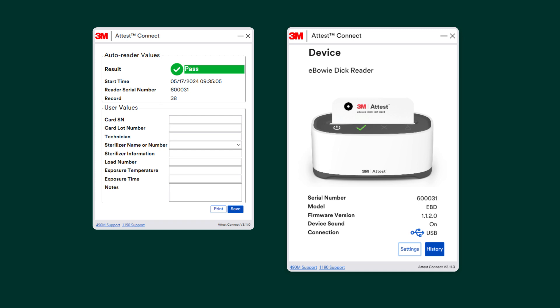In this example, the test card is showing a pass. You are able to add in the card's serial number to help with tracking according to your facility's policy. You can also include the card lot number, technician's name, sterilizer number, and the cycle parameters the test card was run on.